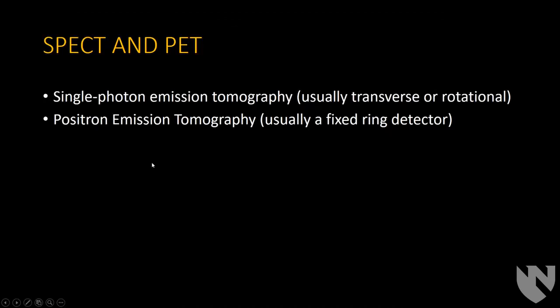Okay, so that's pretty much it for gamma cameras. We'll move on to SPECT and then PET. SPECT stands for Single Photon Emission Tomography. Basically that means you're doing tomography in a rotational direction, so you're going around the patient and making slices through the patient.